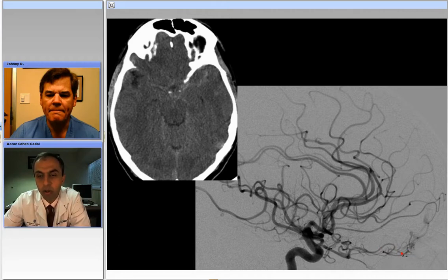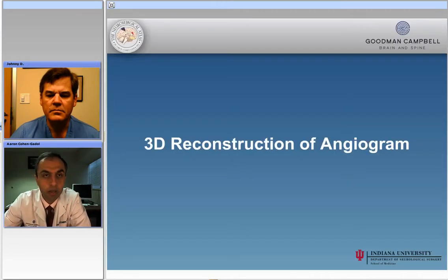However, a cerebral angiogram revealed this abnormal connection along the olfactory tract potentially and the ethmoid area, from an artery directly to a cortical vein. So this would be consistent with an ethmoidal arteriovenous fistula.